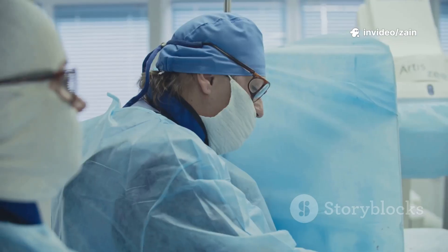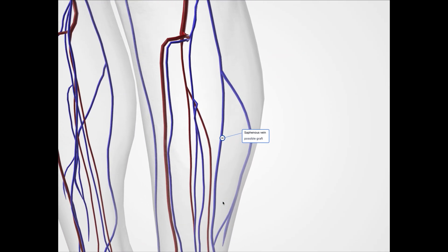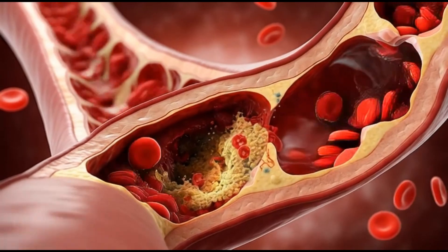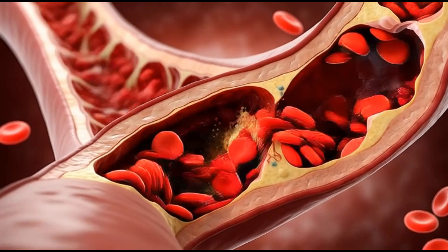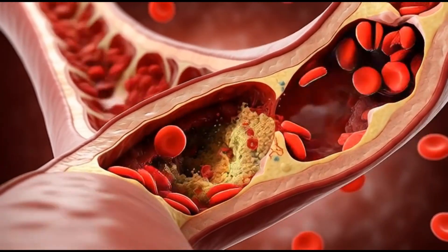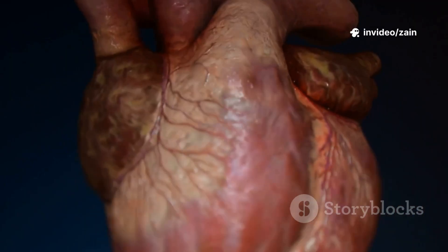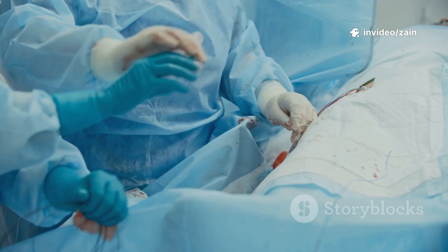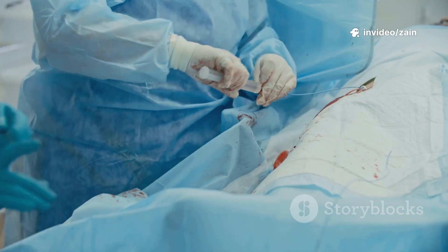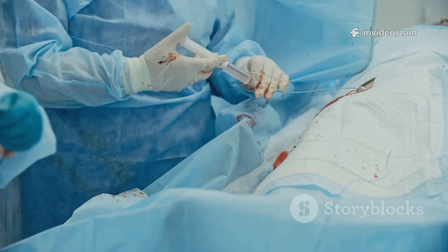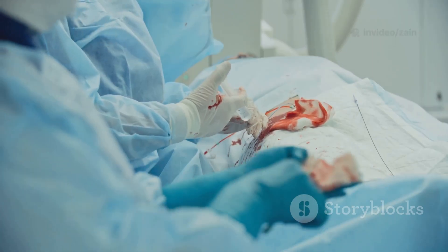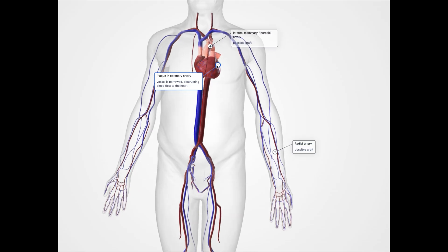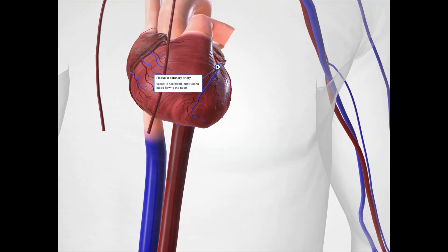During the procedure, surgeons use arteries and veins harvested from other parts of the body to bypass the narrowed or blocked sections of the coronary arteries, thereby restoring an adequate blood supply to the heart. CABG surgery frequently involves harvesting blood vessels from the chest, arm, or leg to be used as conduits in the bypass, followed by joining them to the coronary arteries.